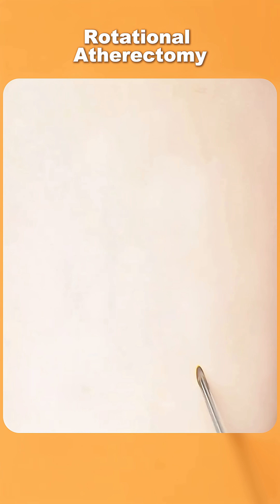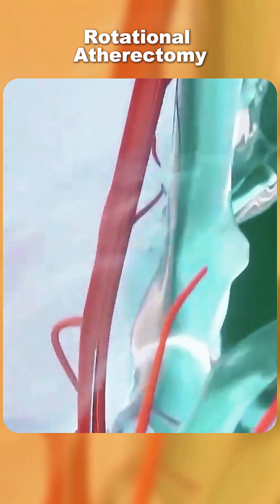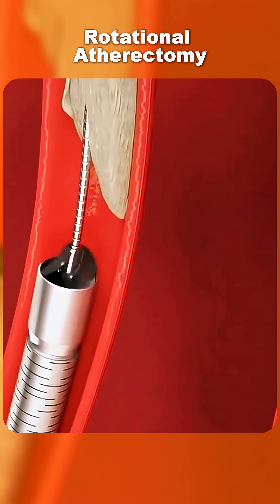In this technique, a cardiologist inserts a thin catheter through an artery, usually from the wrist or groin, and guides it up to the blocked coronary artery. At the tip of the catheter is a tiny diamond-tipped burr.